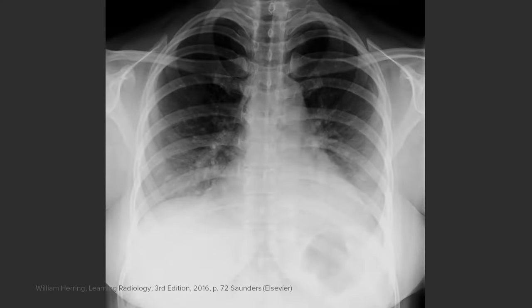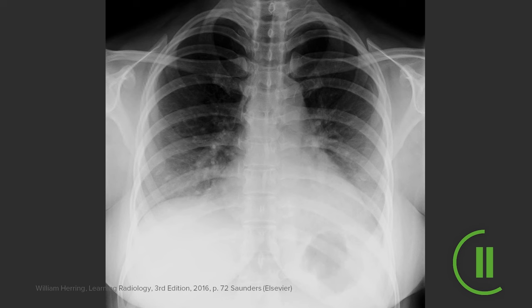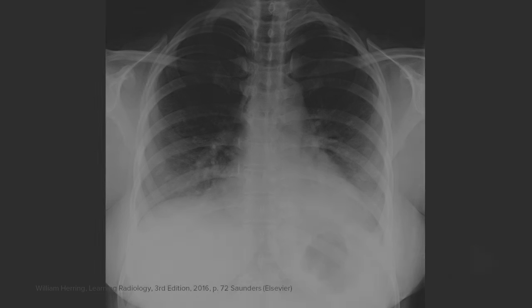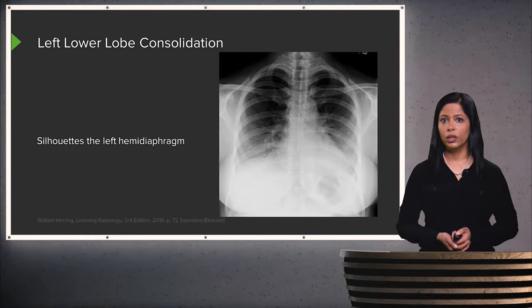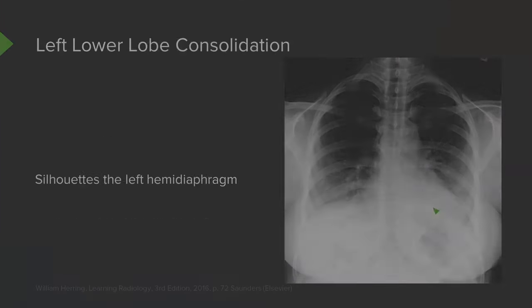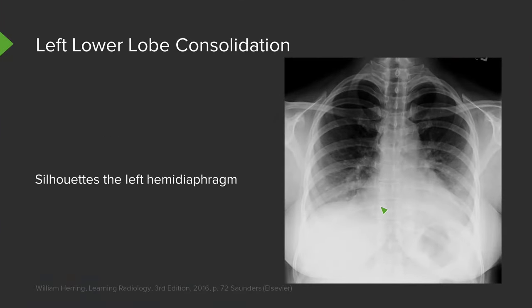This is an example of left lower lobe consolidation. We have silhouetting of the left hemidiaphragm — you can see a sharp margin on the right, but the left hemidiaphragm, which is normally visualized through the heart, is no longer seen. This confirms a left lower lobe consolidation.